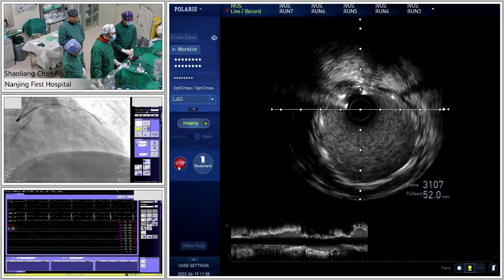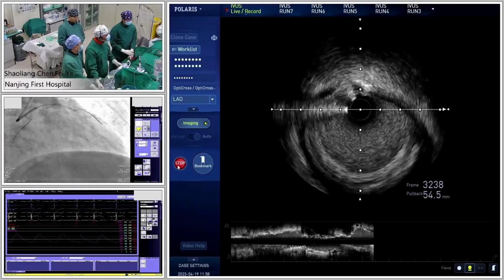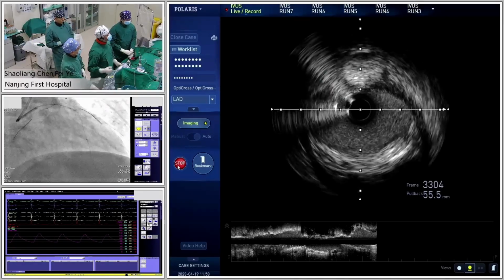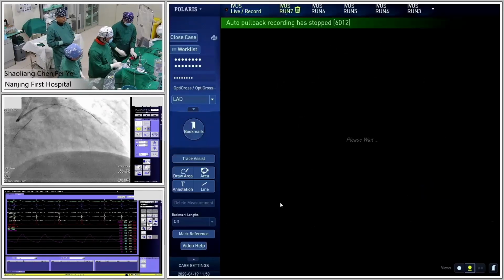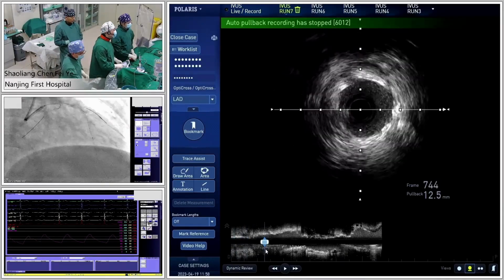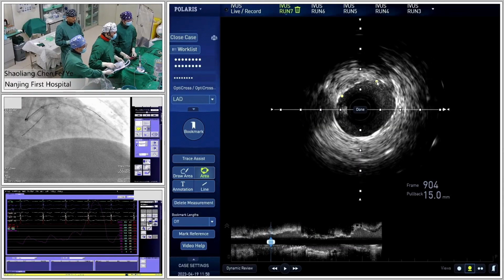Our left main stent was expanded very beautifully. It's the edge of the stent. Yes, no dissection. Good. Okay, so now I think you can start. Do you think you need multiple post dilations for the proximal LAD stent?